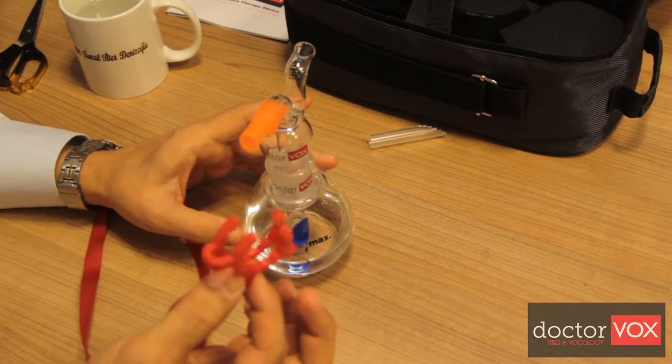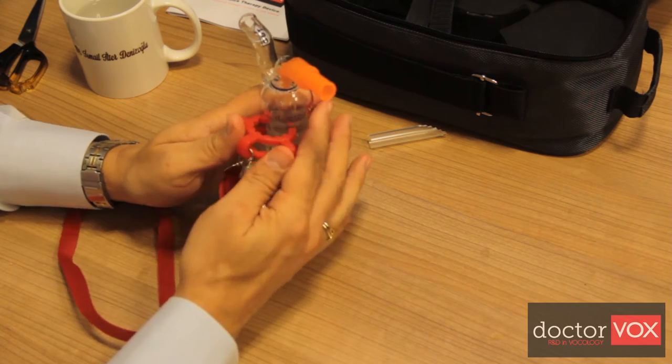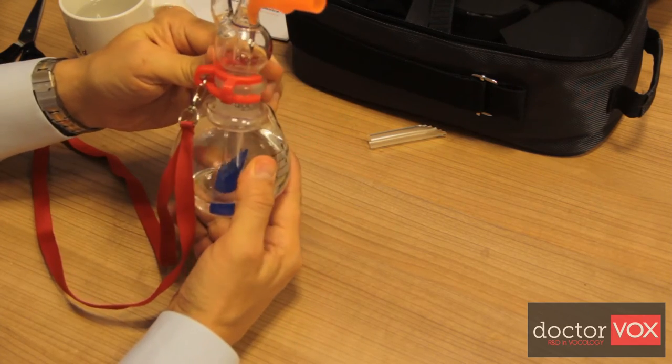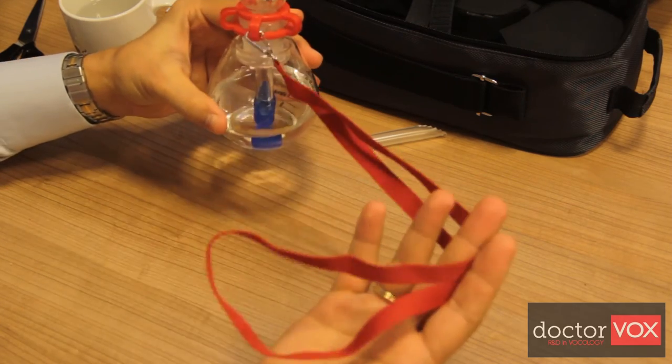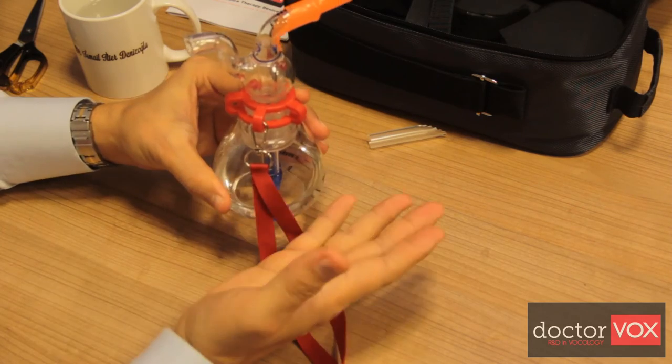These are the locker clips. The locker clips help to lock the two parts of the Dr.Vox device together. There is also a neck lanyard to use the Dr.Vox device hands-free.